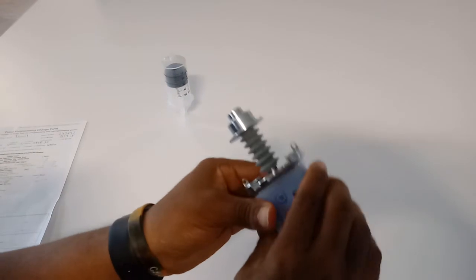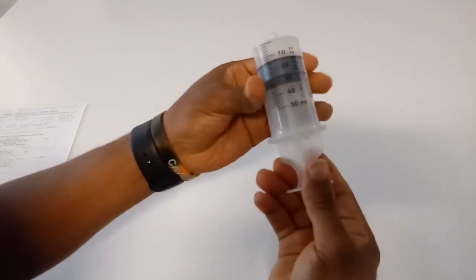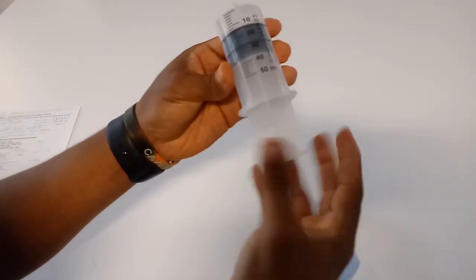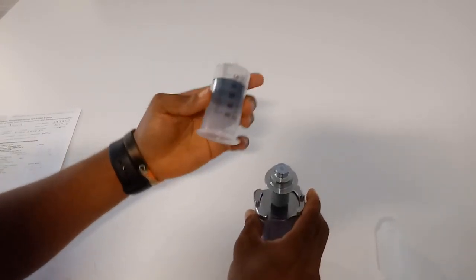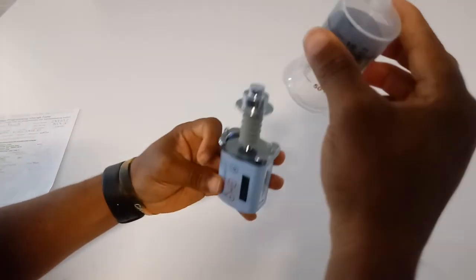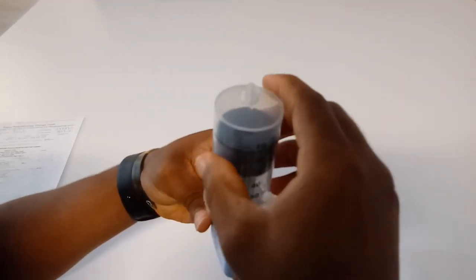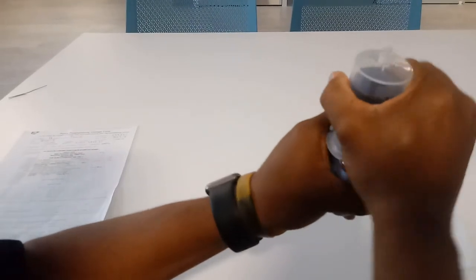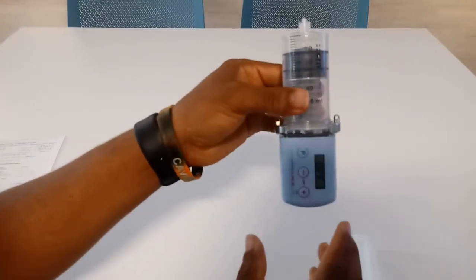Now, the final thing I want to show you is what 12 cc's will look like. So imagine it's already filled with liquid. You're going to unscrew the plunger, and this is how you insert. You've got the pump, you twist it this way, okay, and then you just twist and it locks in, and that's how it looks.